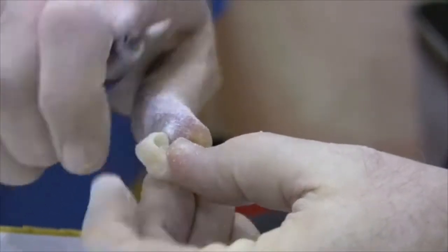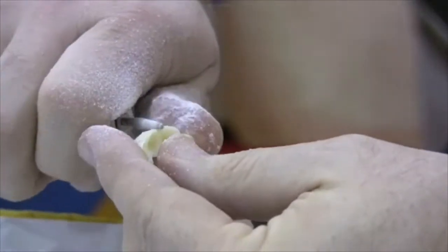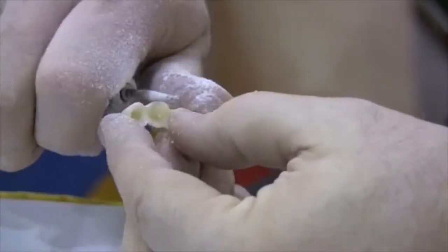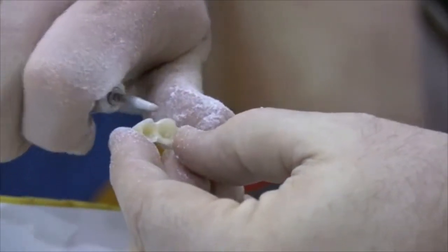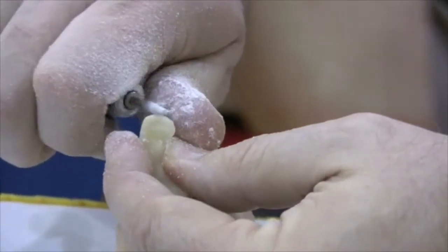One of the downfalls on bisacryl, particularly long span bridges, is the fact that material is very brittle. Tough Temp will remind you a little bit more along the fashions of a methyl methacrylate, which would bend a little bit before it breaks.